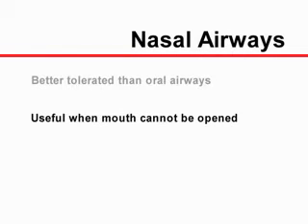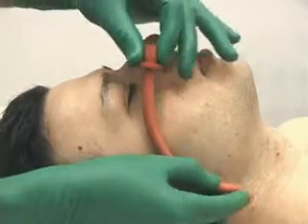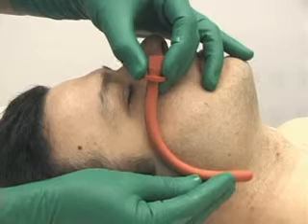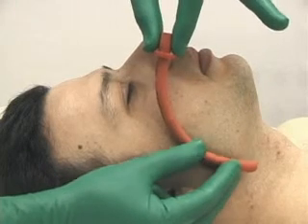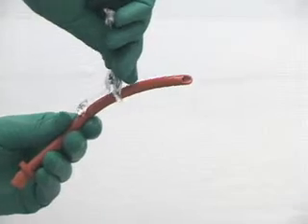They are particularly useful when the mouth cannot be opened. The simplest method of estimating their appropriate length is by correlating it with the external anatomy of the face and neck and taking into consideration the patient's height.